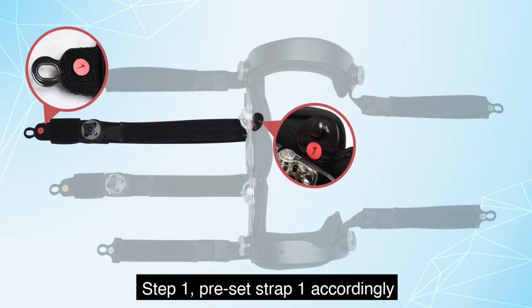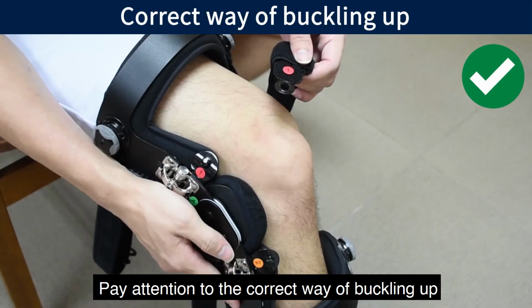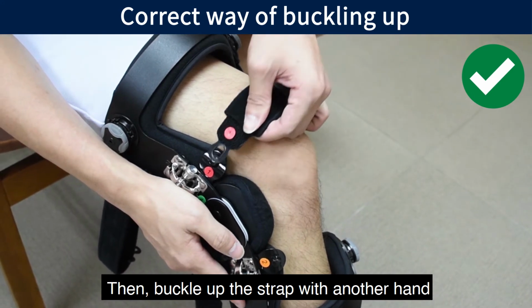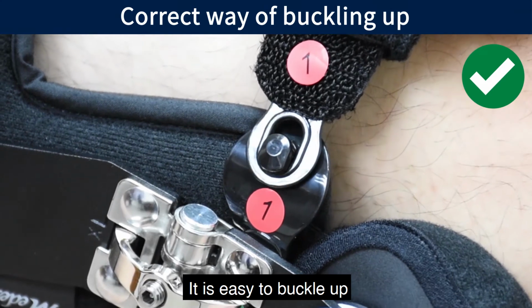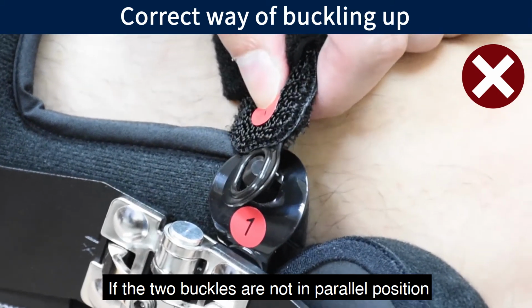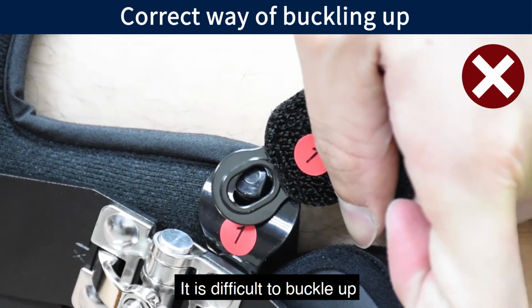Step 1. Preset strap 1 accordingly. Buckle up strap 1 accordingly. Pay attention to the correct way of buckling up, that is, hold the brace firmly with one hand. Then, buckle up the strap with another hand. Make sure the two buckles are in parallel position. It is easy to buckle up if the two buckles are in parallel position, and difficult to buckle up if they are not, that is, tilted or bended.